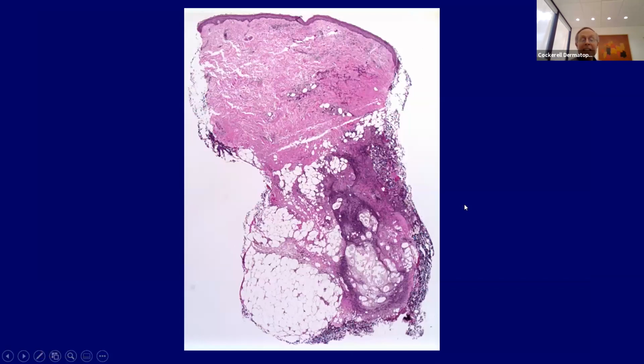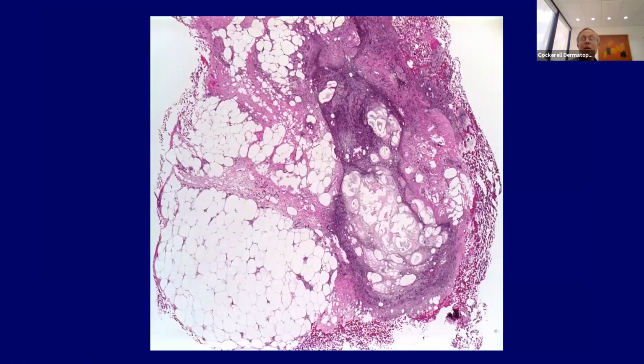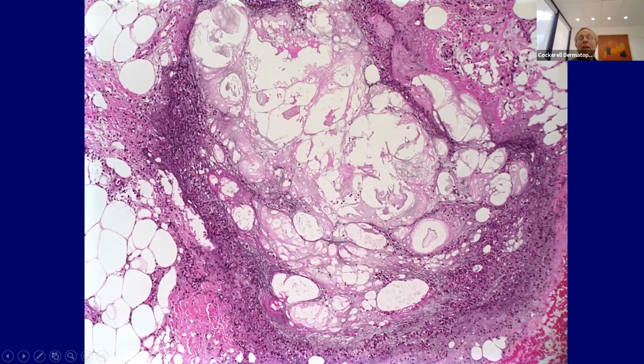And this is the classic histologic pattern of pancreatic panniculitis. Lobular mostly, and the inflammation that comes in is secondary. Main change is the saponification of the fat. This is pathognomonic of this process. So you get these little ghost-like cells here. These are the residuum of all these lipocytes that have been damaged and coalesced to form these fat microcysts. They're calcified, where you get this kind of purplish discoloration that's due to calcification. So this is the chemical calcification.